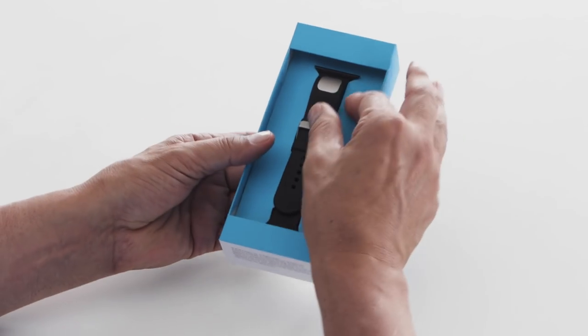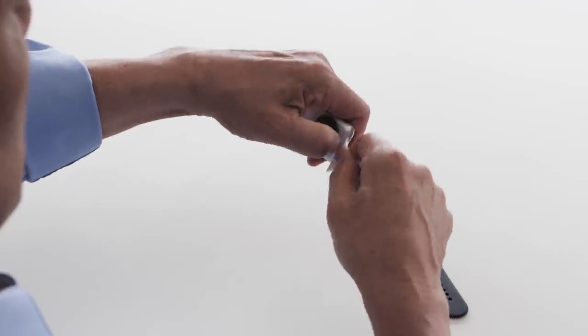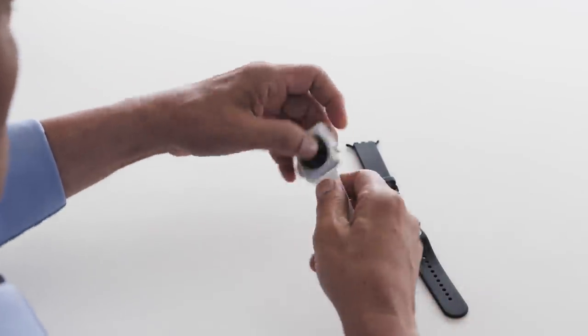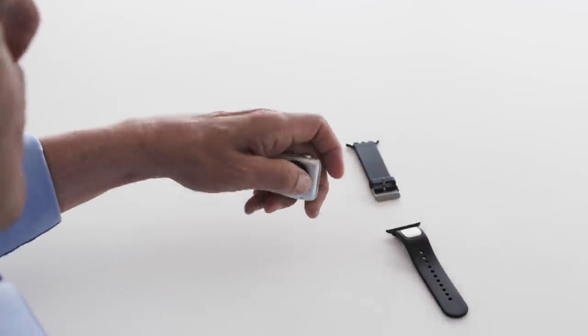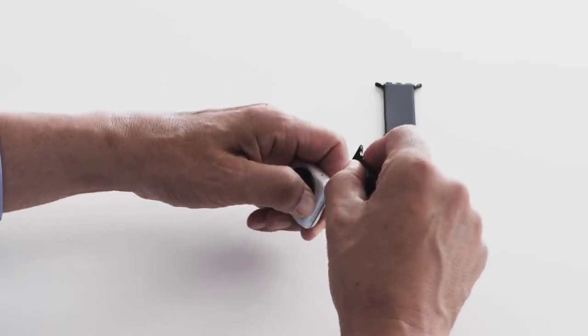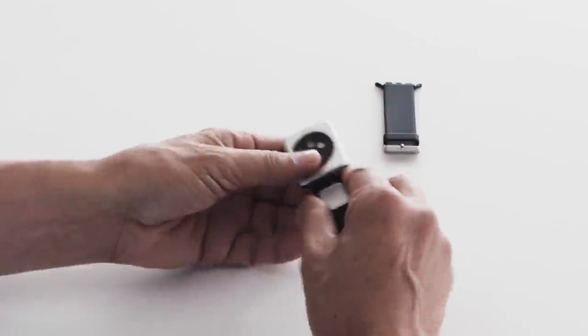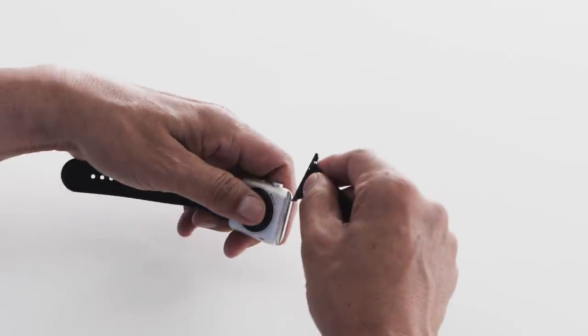Step one: installing the strap. Take CardioBand out of the box. Remove your current watch strap from your Apple Watch. To do this, push and hold the button on the back side of the Apple Watch and slide out the old strap. Then slide in CardioBand. Make sure the strap with the silver square sensor is attached to the 6 o'clock side of the watch.